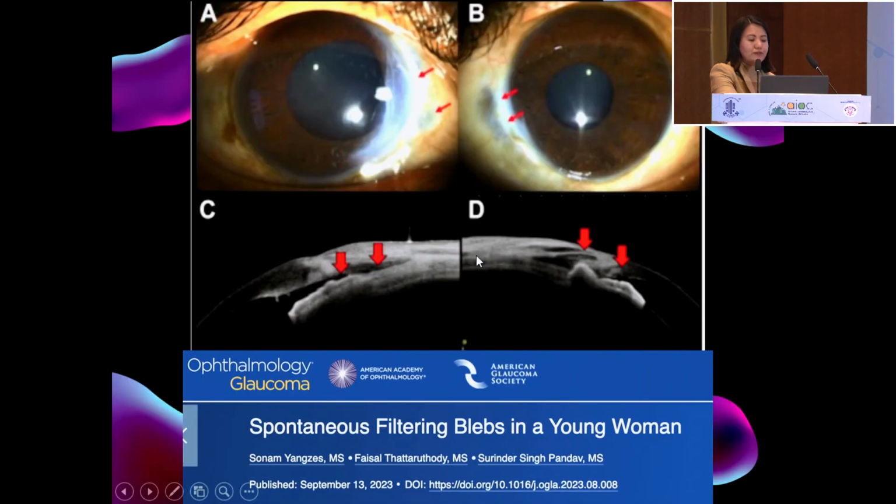Along with that, we can even look at the scarring of the cornea which takes place after resolution. Apart from that, just like our glaucoma colleagues, we use the swept source OCT for determining the height of the bleb and the conjunctival fluid as well as the scarring.